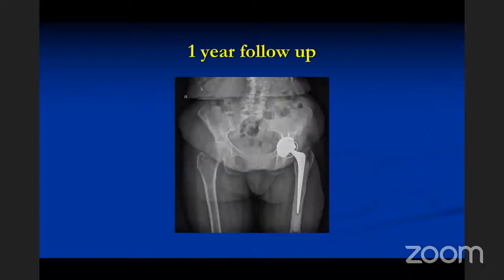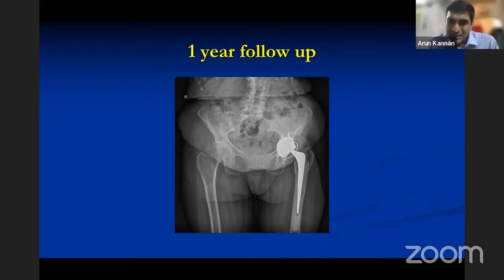And this is the good one, Arun, for a cement-in-cement. You want to change the version. Yeah, it was already in 10 degrees anteversion, sir. So I think they did not change the stem. As I said, I didn't do the case. It was one of my colleagues.